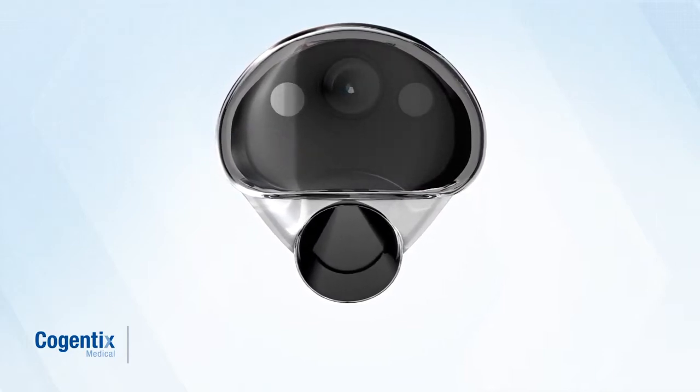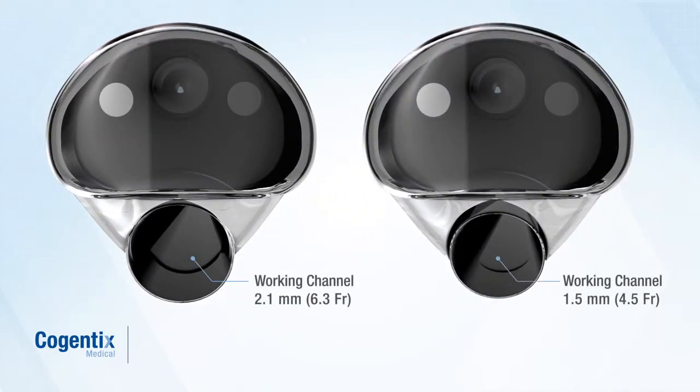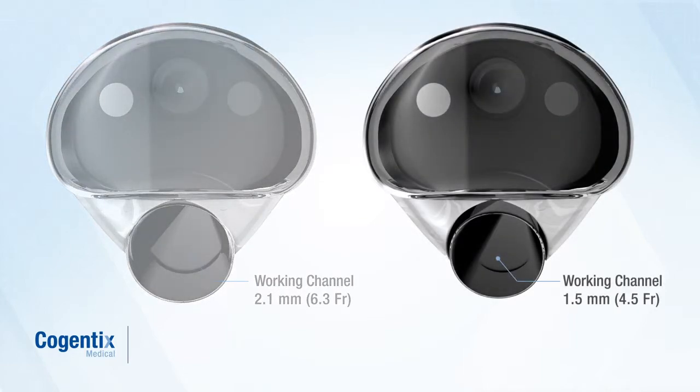The single-use Endosheath disposables are available in two working channel diameters. For procedures that may require use of an instrument, the 2.1 mm sheath includes a disposable working channel for irrigation, suction, and instrument passage. If only irrigation and suction are needed, a narrower sheath featuring a 1.5 mm disposable working channel is available.